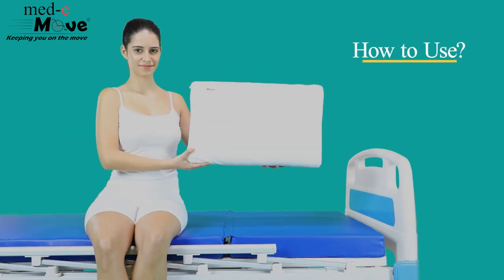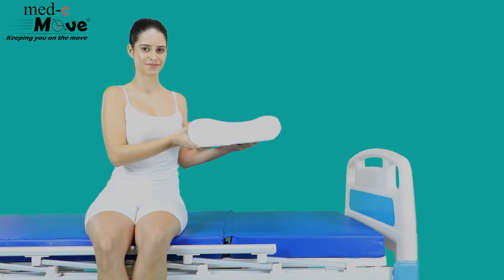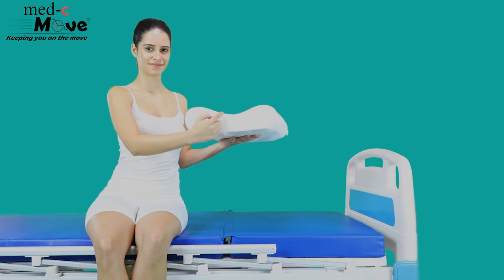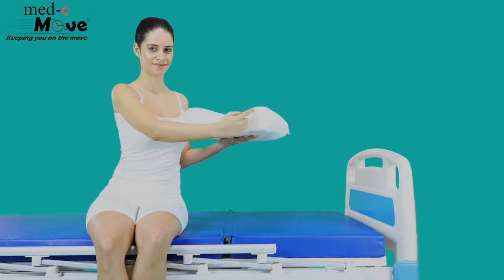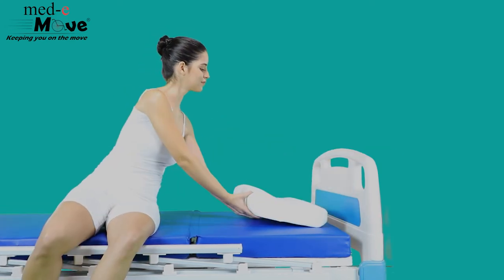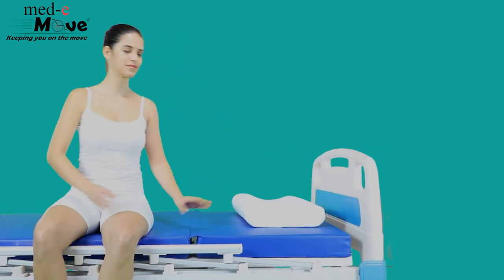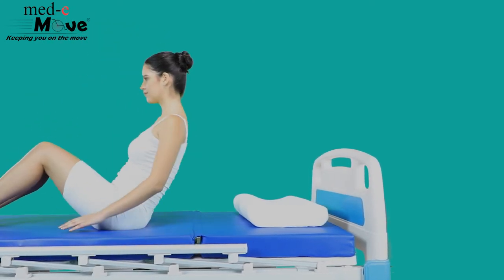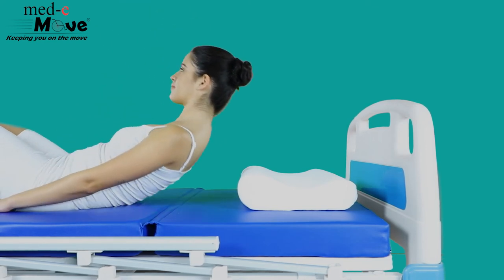Now let us see how to use the Medimove Cervical Pillow. The higher profile is suitable for those who have a large neck. The low height profile is most suitable for those who have a small neck. You can choose the right profile by lying down in the supine position.